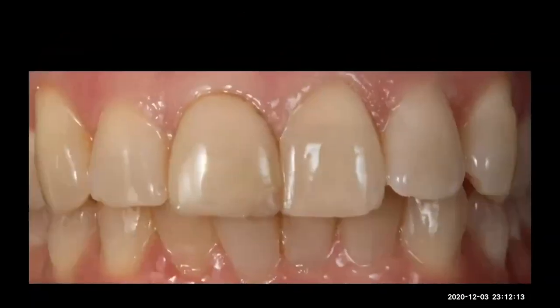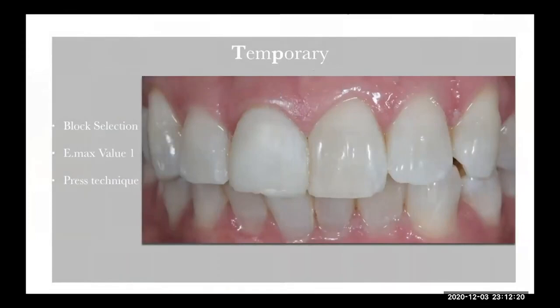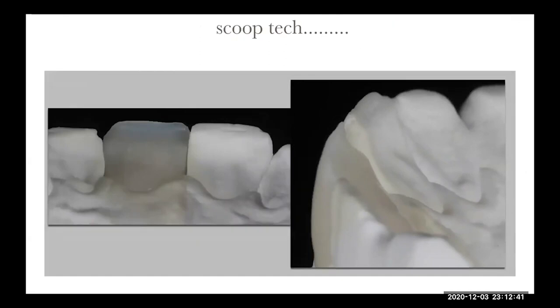So let me show you my first case. This is the initial situation of the patient. We decided to do a bleach, okay? So in that way we pick what kind of ingot we want to use, and the technique and everything. In that case, we already have the pressed tooth in the solid model. And you guys can see that we reduced the lingual part like 2 millimeters inside, okay? And you see, 2 millimeters. So we create a thin wall.